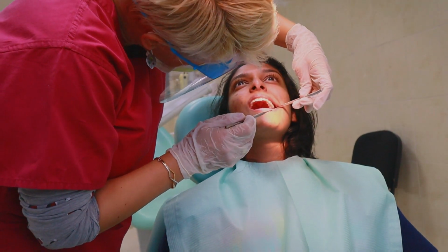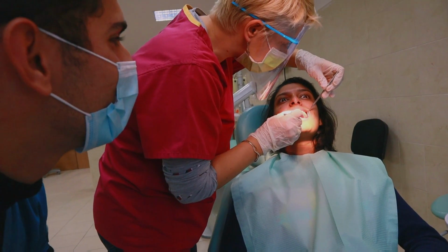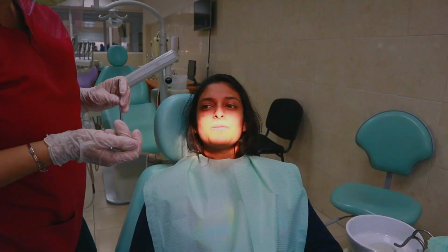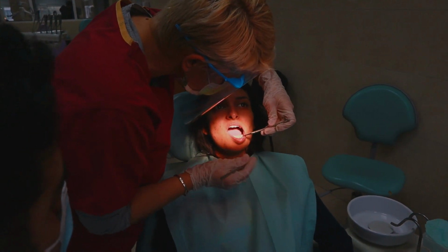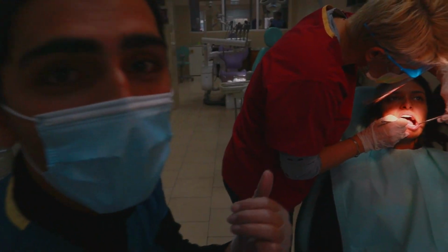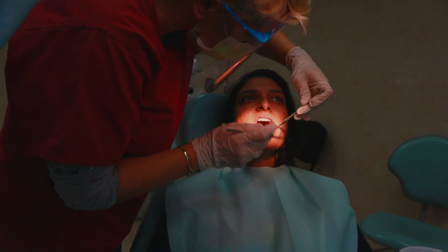Now once I am done with the checkup, the teacher does a quick checkup too, just to ensure that I've done my job correctly before we can start working on any problems the patient has. In the UK they have a lot of fluoride in the water, so a lot of us have fluorosis because of it. Look at her white. I was right, guys. I mentioned there's fluorosis. The doctor's noticing it as well. So, again, fluorosis here.